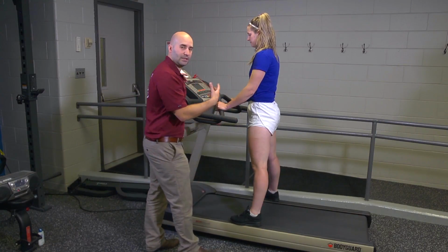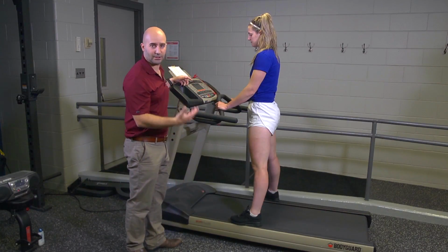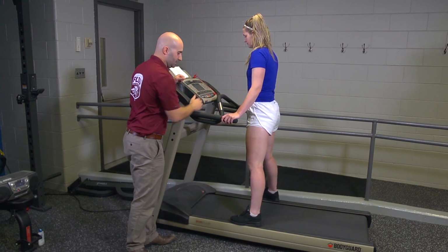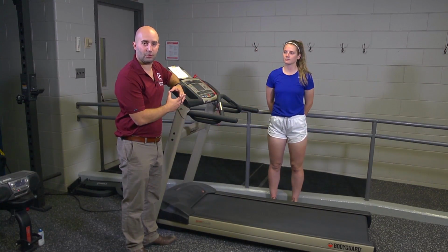And once again, if she looks like she was weak or stumbling, I would position myself in this case to potentially help her from stumbling backwards, etc. And now that she's off, you can just push the stop button and she could step off the treadmill and the test would be done and you would immediately begin your cool down procedure.